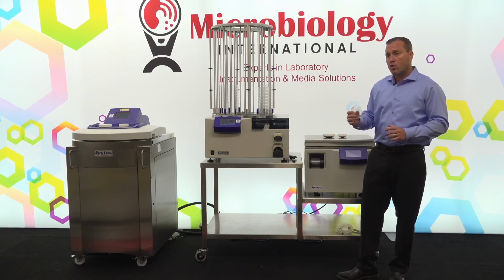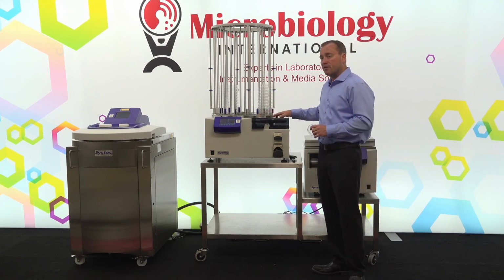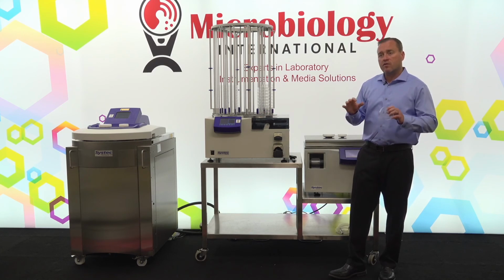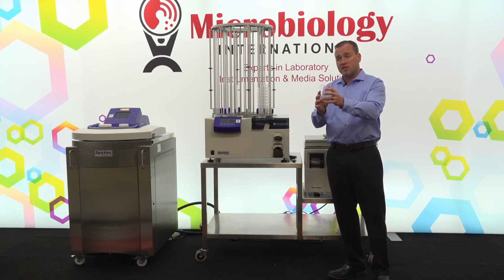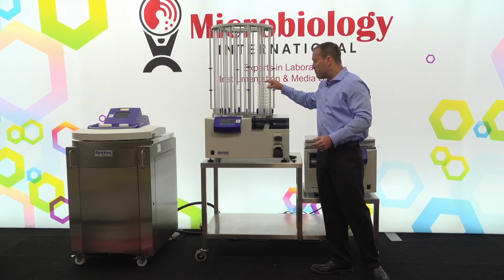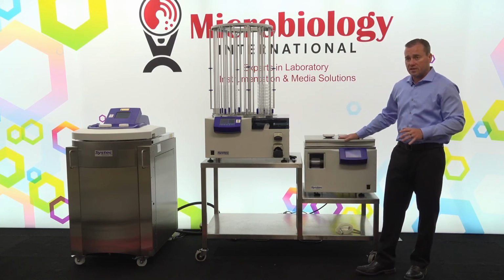In addition to the normal cleaning that you would do with this, in order for us to maintain sterility, any hardened media that gets down into the filling chamber will get spore formers inside of them. So if we keep that really nice and clean, those spore formers go away, and we don't have to worry about that point of time when the lid is actually open for any dusting to come and settle on the top of the plate. So as far as to sum up that answer, I'd recommend a thorough cleaning of this once a week, anytime that it gets a spill, and then just run the cleaning cycle once a week.